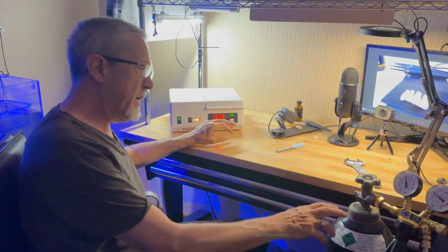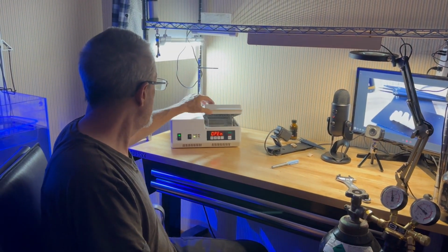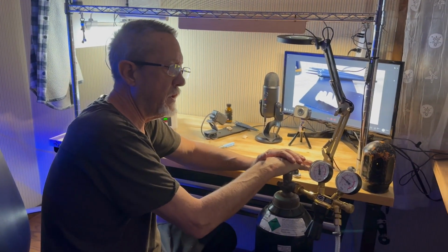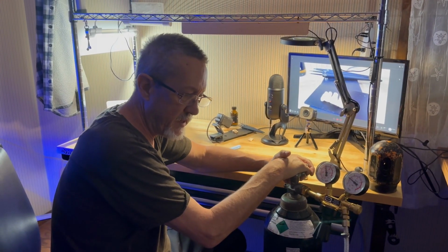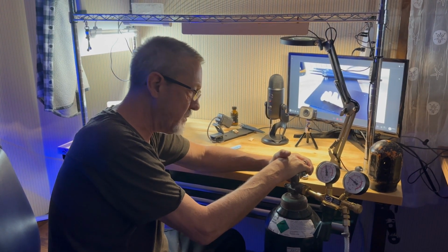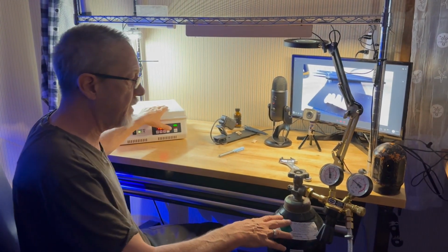Now this is an 80 cubic foot tank. I'm going to run it by real quick for you. Let me shut that off. We've just proven what we were doing. With an 80 cubic foot tank, there are 29 liters of gas in a cubic foot, so that works out to 16 liters per firing, which is about 150 firings.